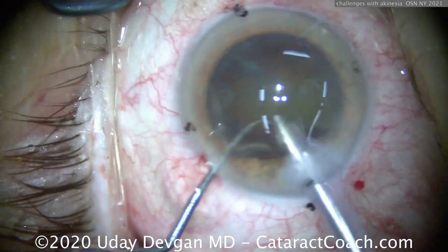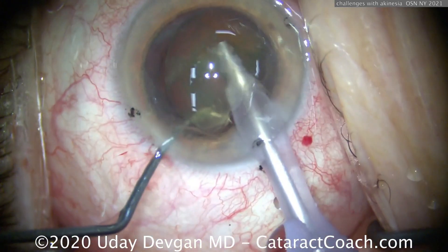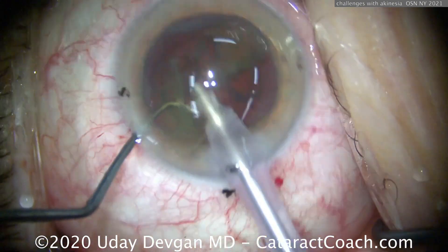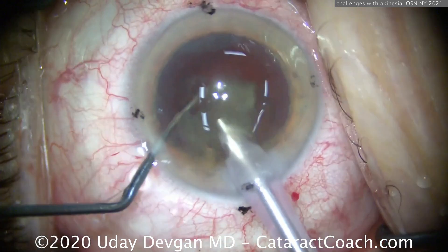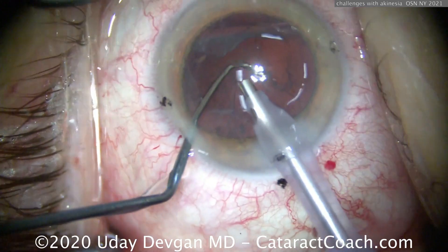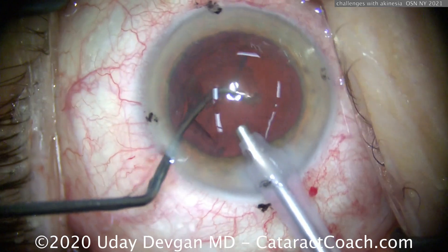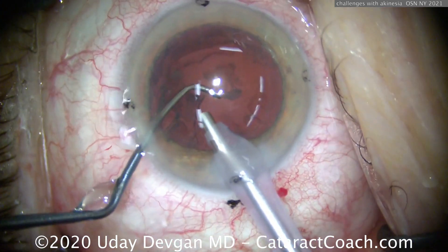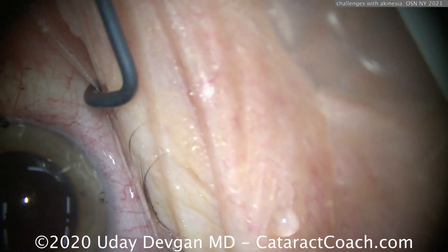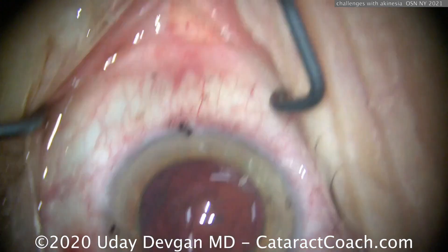We're in a nice little window — I try to be super efficient here. I'm operating outside the capsule bag, bringing the nucleus up to the iris plane rather than operating within the bag. Just like that — got that nucleus out. Come out of the eye, give her a little break. Now let's get the epinuclear shell while she's still relatively still. Chopper in the safe position — don't let that capsule come up near the phaco probe. Just in the nick of time — there's the next motion. The patient obviously has a lot of systemic problems and we're happy we could do this surgery.